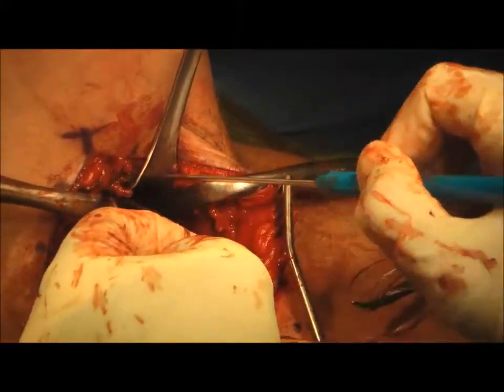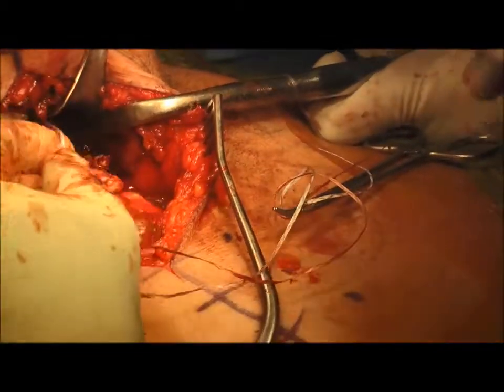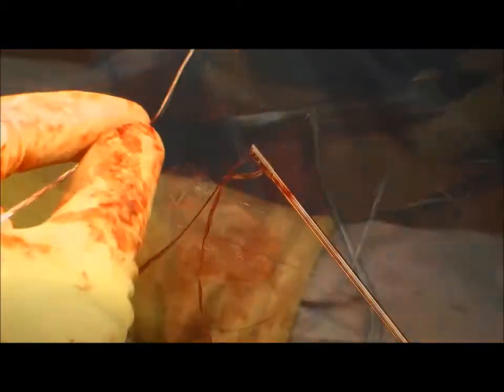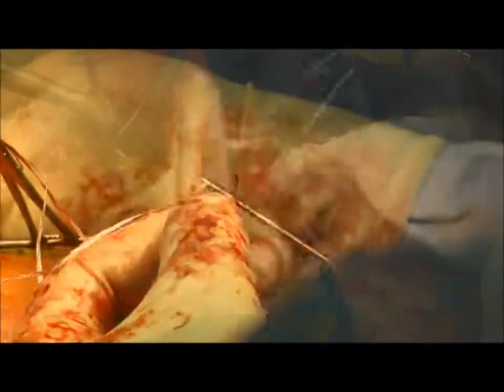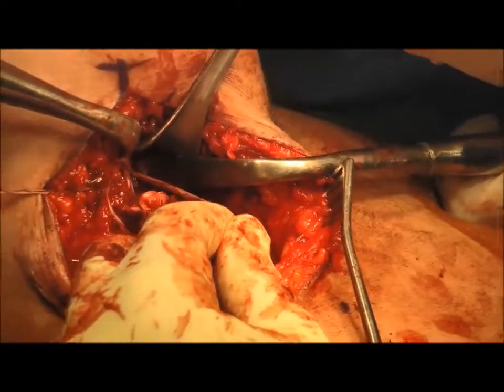Once inserted, the sutures are pulled on to ensure stability and that the button has flipped and is abutting the cortex. The second set of suture tape is loaded onto the button in the same manner, and the button is inserted into the cortex. Again, a forceful pull confirms stability and that the button has flipped.